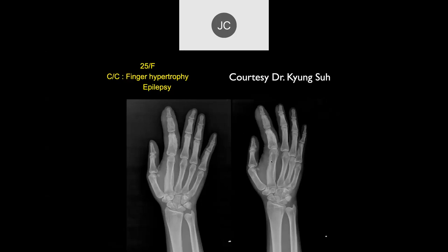25-year-old female with finger hypertrophy and epilepsy. The second proximal phalanx looks thickened with a lot of periosteal reaction. When you get swelling and inflammatory changes in one digit, the first disease we usually think about is psoriatic arthritis. But this patient had epilepsy, which typically isn't associated with psoriatic arthritis, no evidence of psoriasis, and the periosteal reaction is more marked than the tenosynovitis and soft tissue edema we usually see in psoriatic arthritis.